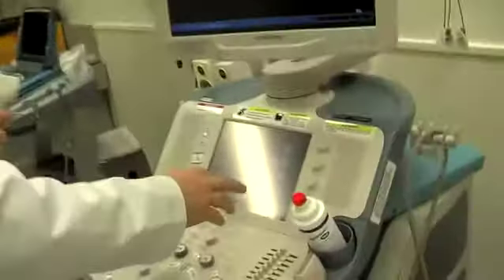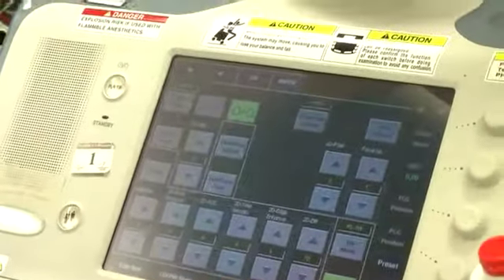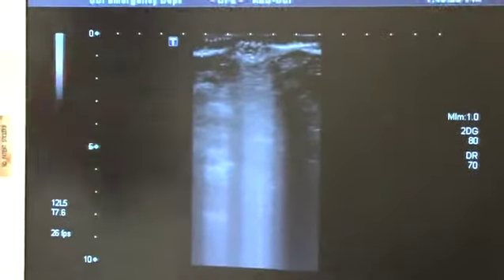So again, to switch the probe, go up to the probe menu, and let's see, PLT 805. Okay, now touchscreen. Now it'll change my footprint. This is a linear footprint. The indicator's to the patient's right. All the patient's information is in. Okay. Again, I want to make sure the indicator is to the patient's head or to the patient's right.